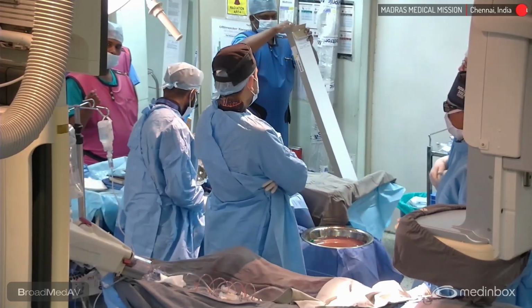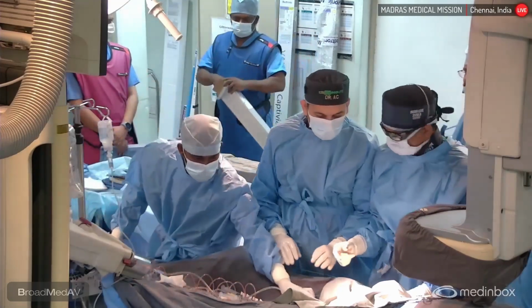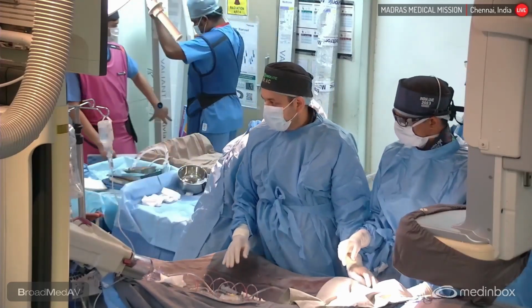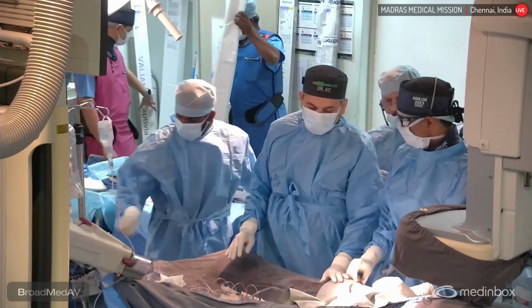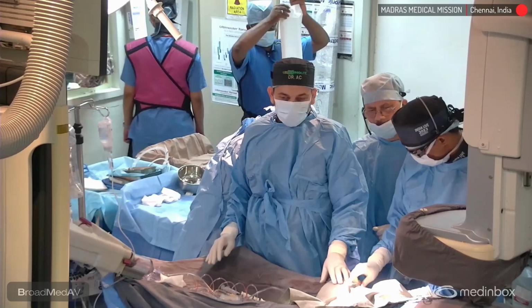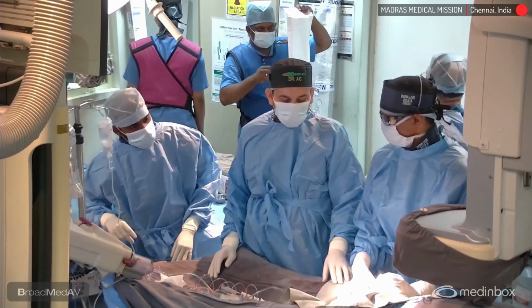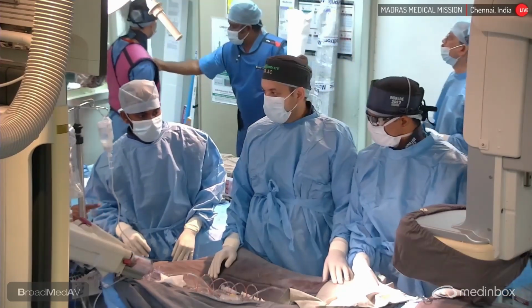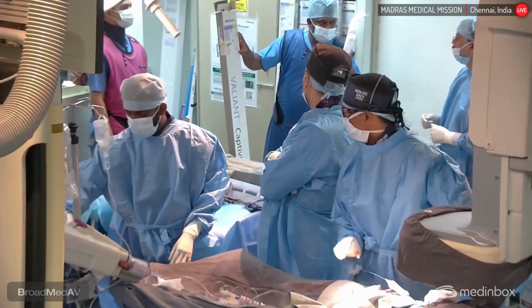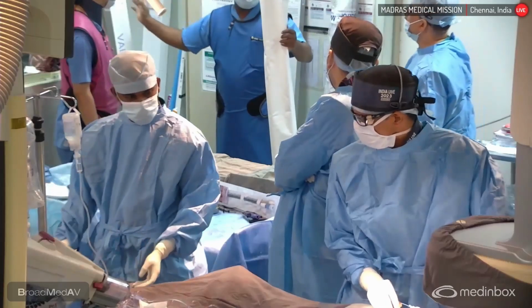Okay, to do that, I once again, no, dilator we cannot do. You just give me a JR or something. Now we have to prepare the device and take it in, or else we have to keep the wire in the ascending aorta. Okay, I will hold the groin. In the meantime, you give me some sheets. Give me a 14 sheet. 30, 120.